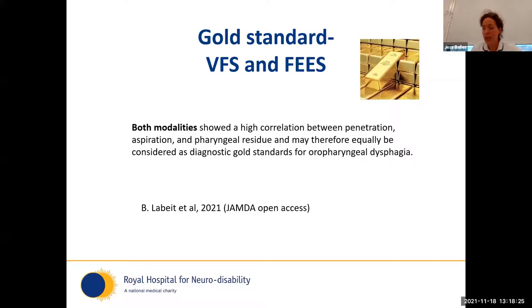There is other research that varies on which assessment is more sensitive to the detection of aspiration, penetration and residue. Kelly et al. in 2006 and 7 found that penetration and aspiration residue scores were rated higher in FEES than in video fluoroscopy. And this was confirmed later by another study by Pisegna and Langmore in 2016. So we just need to take this into account when analyzing FEES, to make sure we're not potentially reporting dysphagia as more severe than it is, if the research indicates that we're identifying more episodes of penetration and aspiration, and greater amounts of residue.